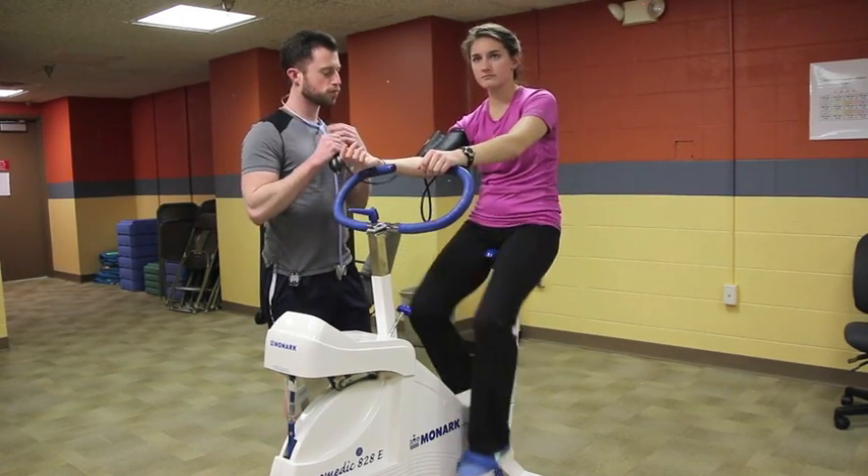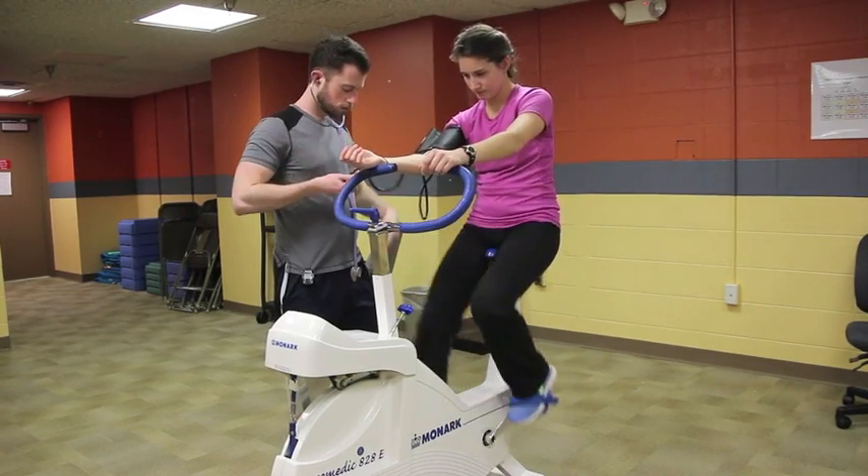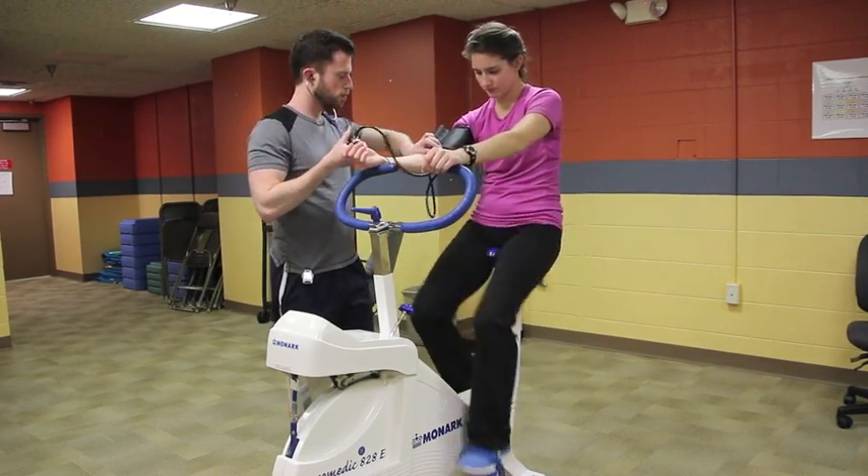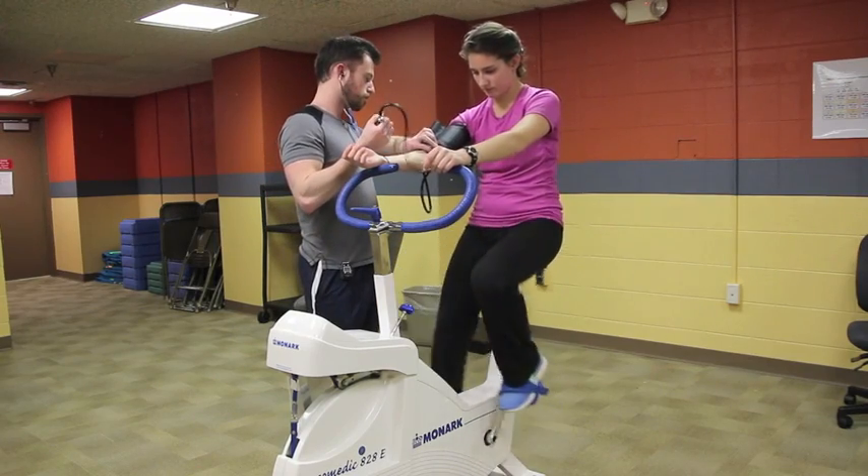The heart rate must reach a steady state with values between plus or minus 5 to 6 beats per minute in order to continue to the next stage.